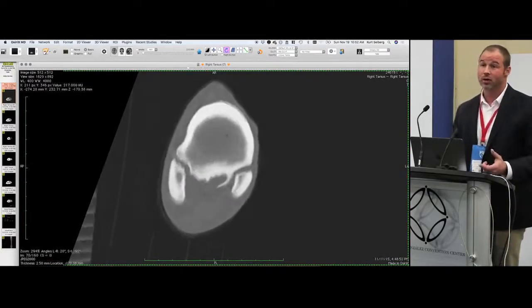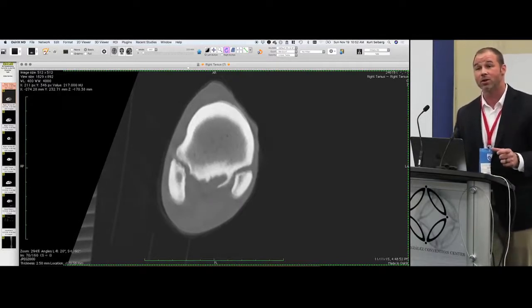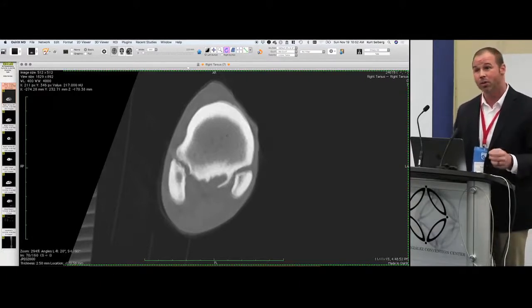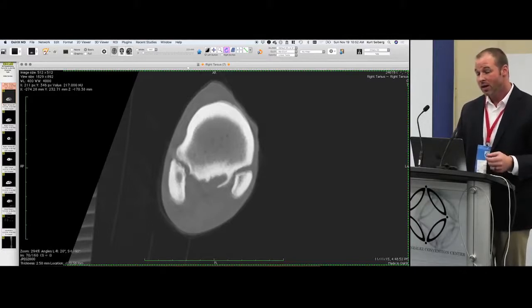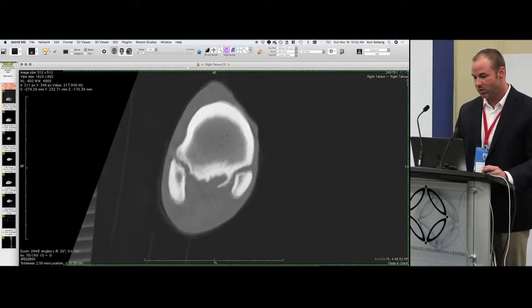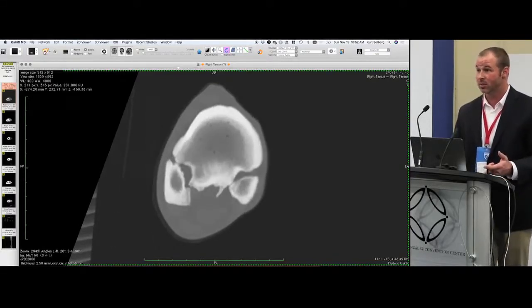And we know that ultrasonographically we're getting much better at looking at this area, and by comparison with images from our ultrasound and our CT, we're getting better at diagnosing small minutiae on ultrasound. But there are definitely areas that are a bit of a challenge to diagnose. Because it's a limited acoustic window, some ultrasound technologies are better than others, and so it depends on what you have.